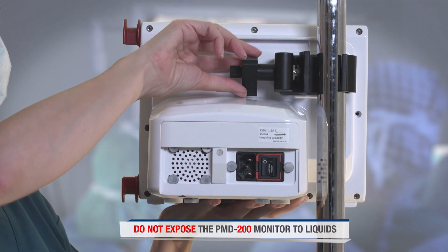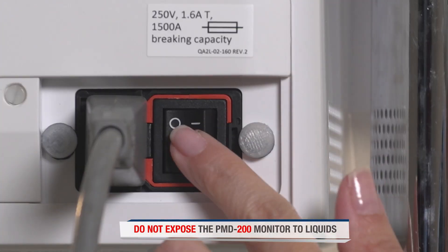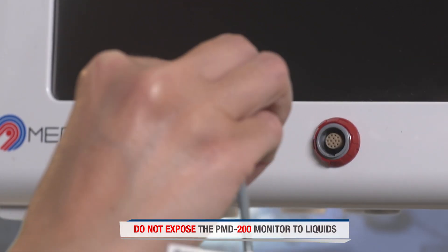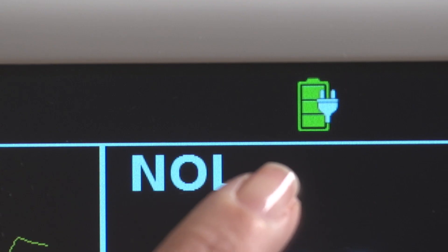First, mount the monitor or place it on a stable surface. Connect the power cable and turn on the switch on the back of the monitor. Connect the finger probe to the monitor and turn it on. Make sure the power icon indicates an external power supply, not battery.